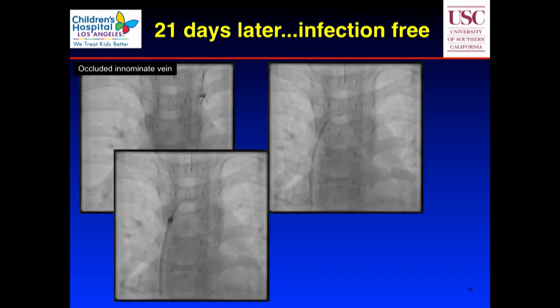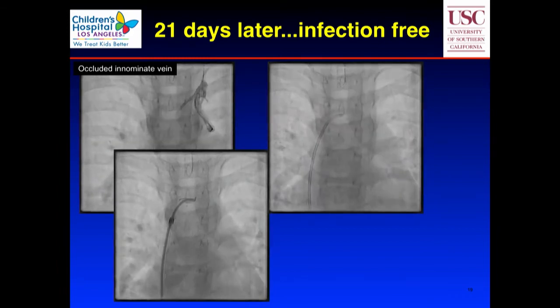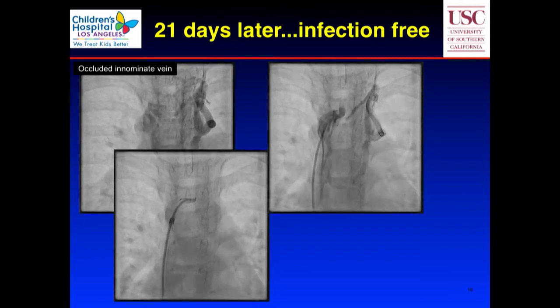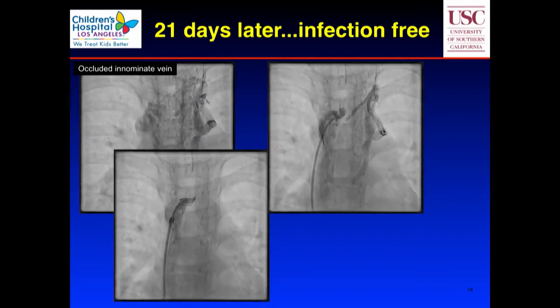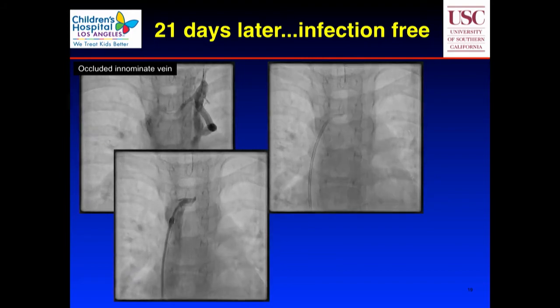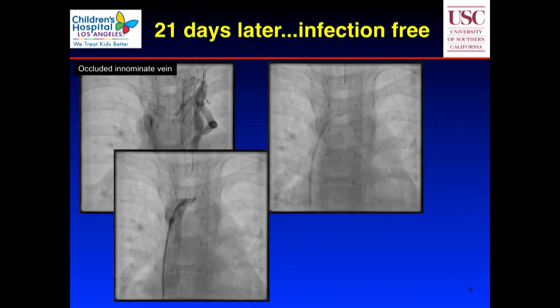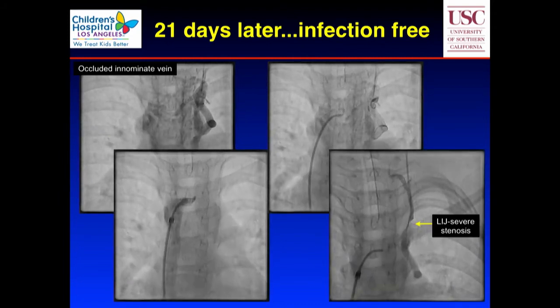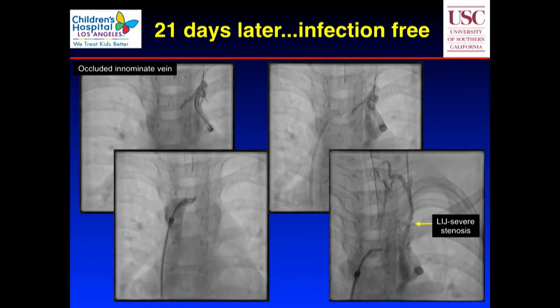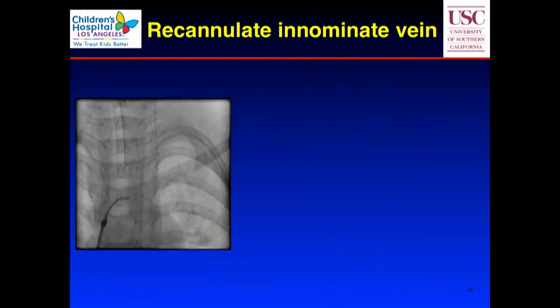There's no blood there. So we're making our way out there, and finally we see there's a tiny little remnant vessel connecting the two. Again, that's where the old line was. Of course, that's gone now because it was pulled 21 days ago. But if you left it alone, that's going to scar down, and you'll forever lose that left IJ for future access. But what we end up doing was that we end up recannulizing that. So you see how the left IJ is tiny. It's like a thread. That's the remnant of what he had left from the line. And so we're able to actually recannulate that.